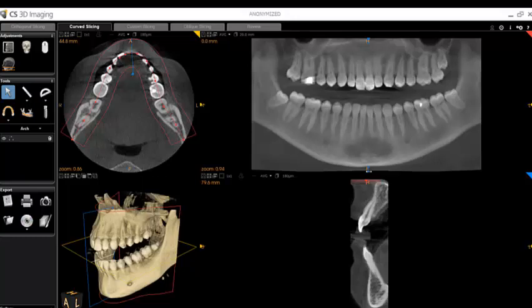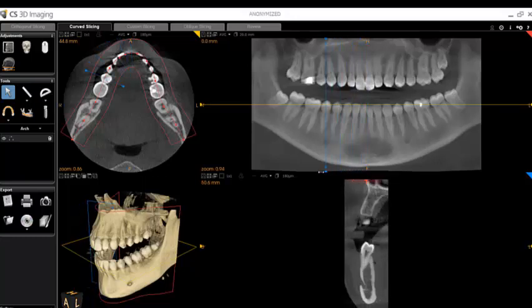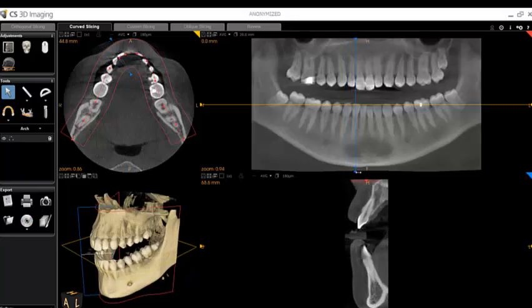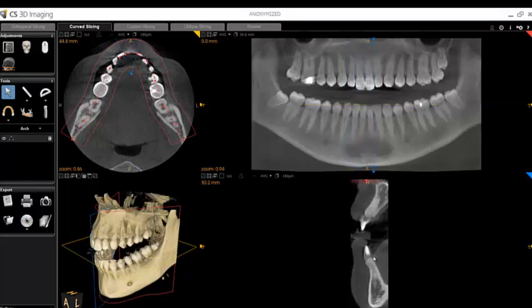You may use the large blue ball in the panoramic image to move through your cross-sectional view. Or, again, for incremental movements, simply place your mouse over the image and scroll with your mouse's scroll wheel.